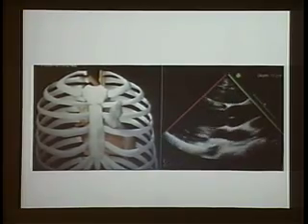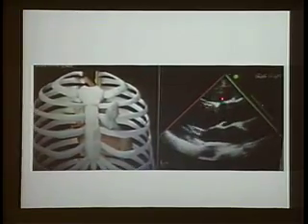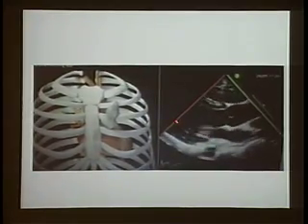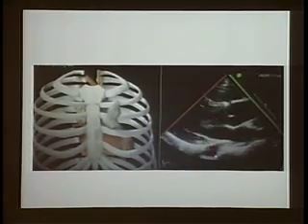And this is what we get. The top here, this is the RV. This is the interventricular septum. This is the aortic valve. You see your mitral. LV here. This is your LVOT, as you eject blood here. This is the left atrium.